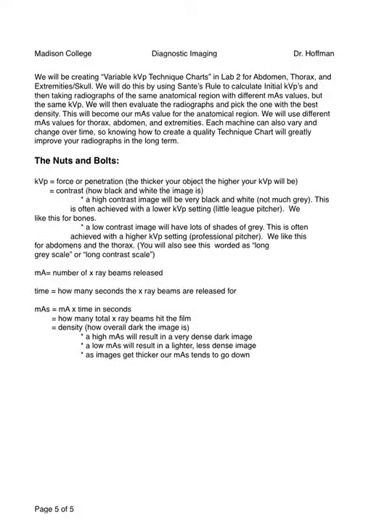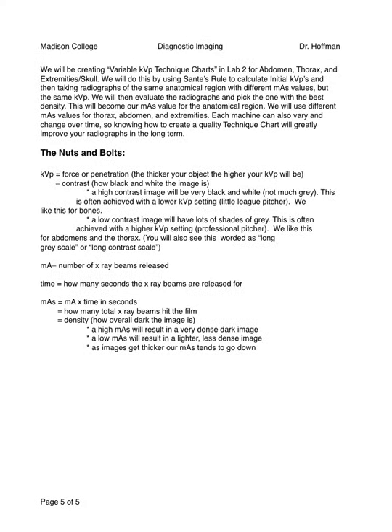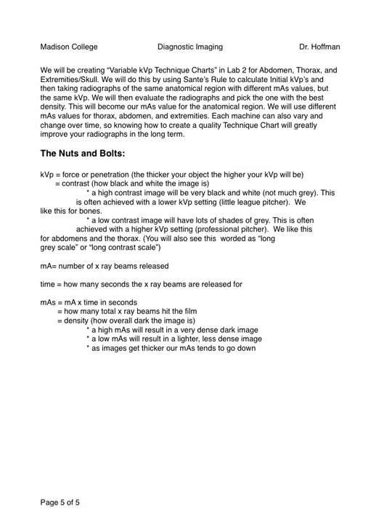Last page of my handout here talks about some technique charts we're going to be developing. We are going to be developing those in Lab 2. We're starting to talk about them already this week in Lab 1. And you're going to have some assignments this week on Blackboard where you're going to be talking about these technique charts and starting to dive into how we actually create these and what they actually are. But this is where we're going to be using our knowledge of MAS and KVP and applying them to the actual animals that you guys will be radiographing for the rest of your careers.